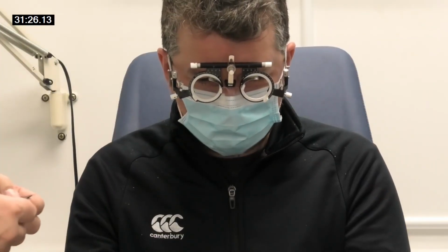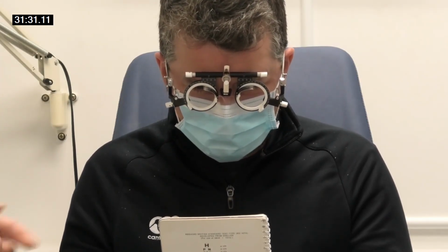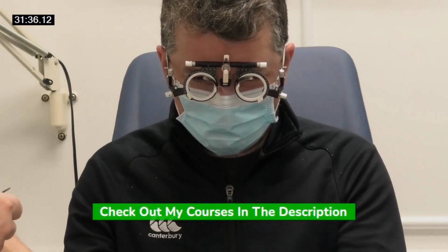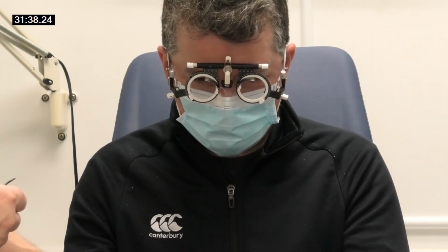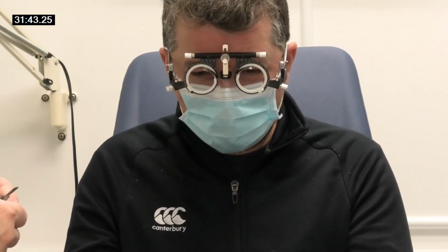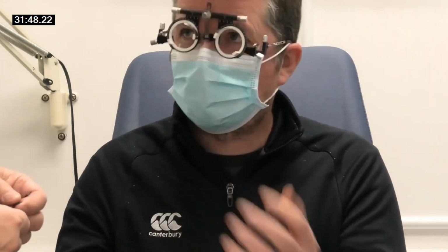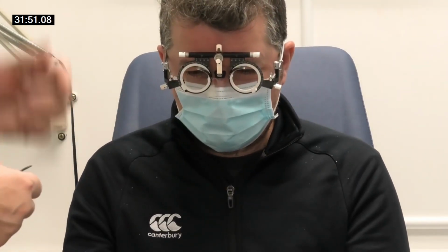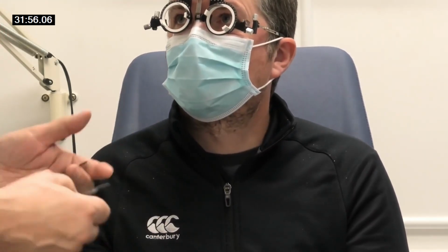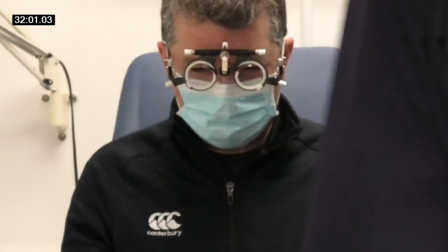Yeah. Just see how close you can bring it. There. Just about there. So that's pretty good, isn't it? Yeah. You know, when he starts to go back down here, then that's when you're going to probably need it. And you haven't really noticed too much trouble reading, have you? No, not at all. It was just because I'd noticed something when I brought something closer before, and I felt it. That's normal. That's the lens in the eye tightening up. So as time goes by, you will need reading glasses, but you're probably not ready for those. Does that sound about right?